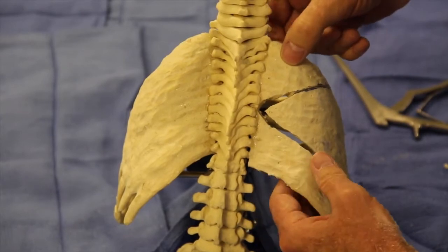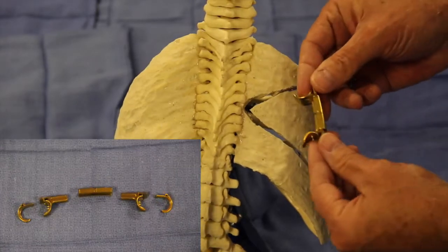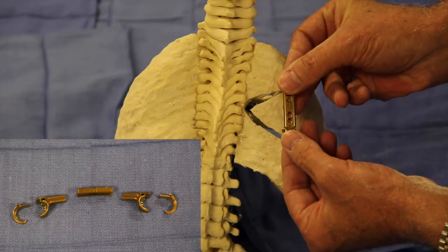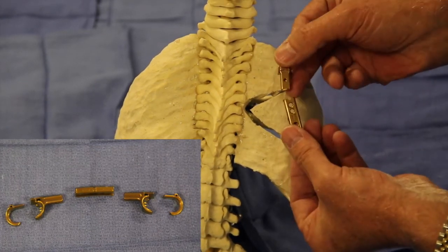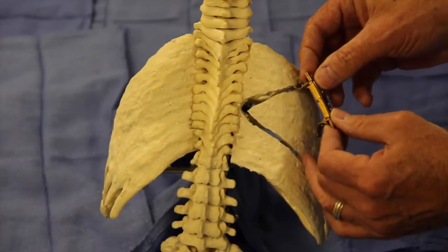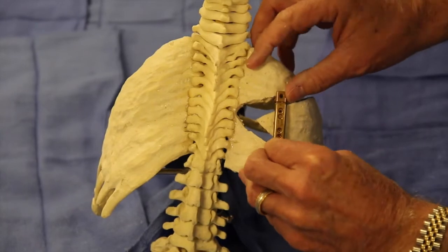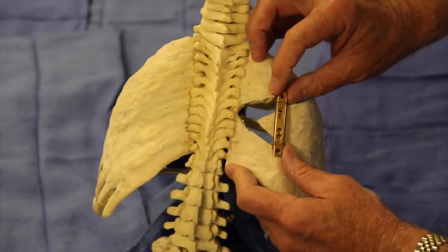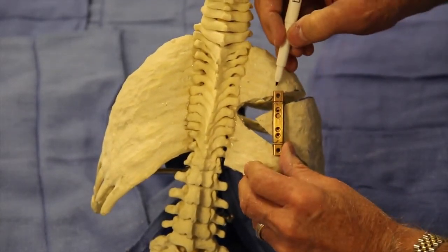Once completed, you spread the proximal and distal fused rib mass, and the apex tends to spread laterally. The vector is usually a number four — the smallest available — and it is wedged laterally and then pushed medially to help distract the proximal and distal portion of the fused ribs apart. The central apex automatically spreads lateral, as seen in this model. Pushing it more medial gives you more vertical expansion of the operation.